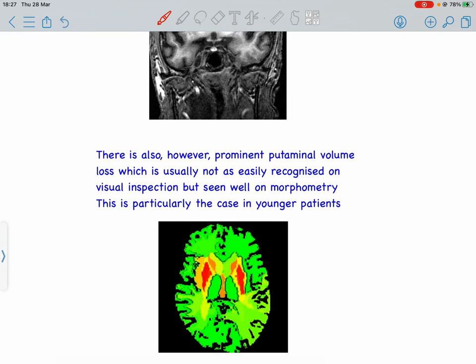There is prominent putaminal volume loss that is not well appreciated on visual inspection but is well seen in morphometry. This is particularly the case in younger patients. In this red color morphometry, we can see the prominent putaminal volume loss.